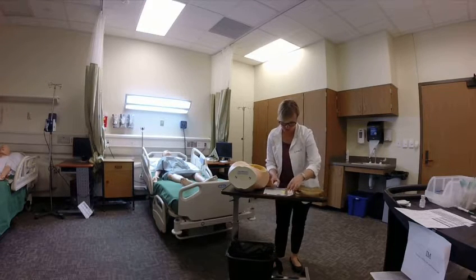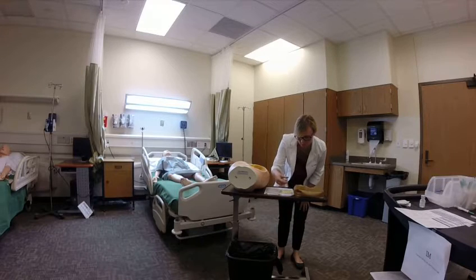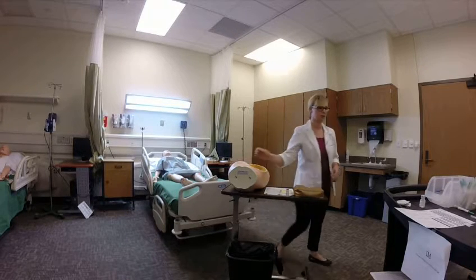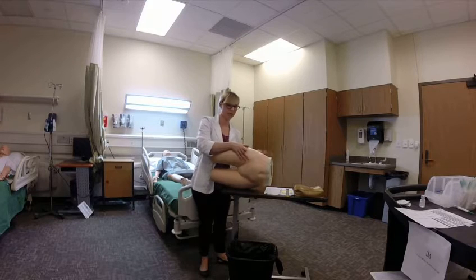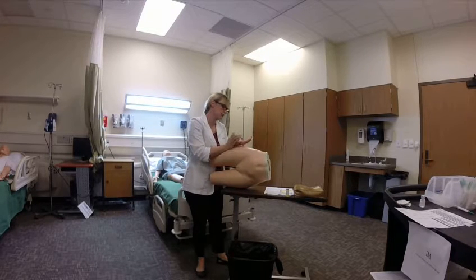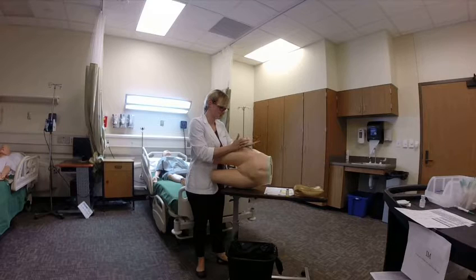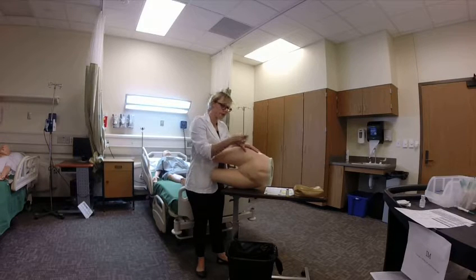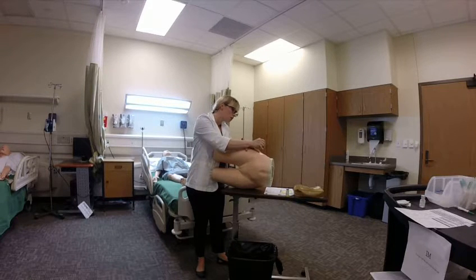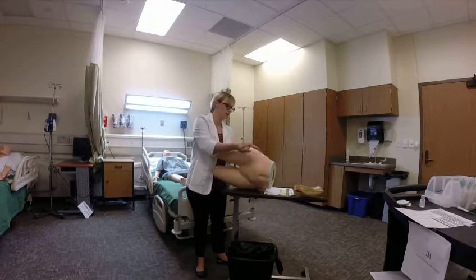I'm going to do my third check here at the bedside. This site is what my preceptor showed me when I first started at Baylor — this is the one I prefer. Palm of hand, thumb towards groin, point to the sky, middle finger move back — and there you go, right there. Instructor, is that correct? Good. We've got the correct site.